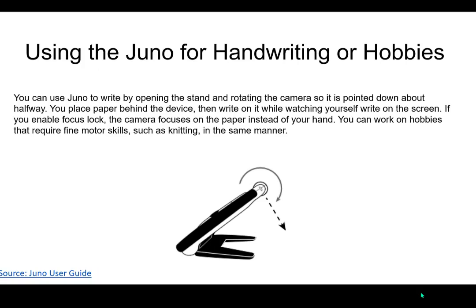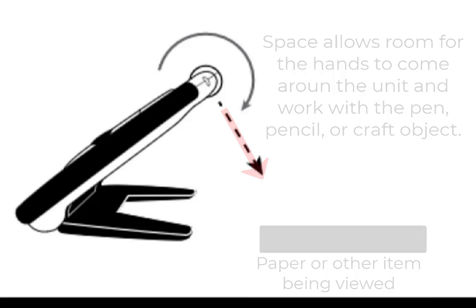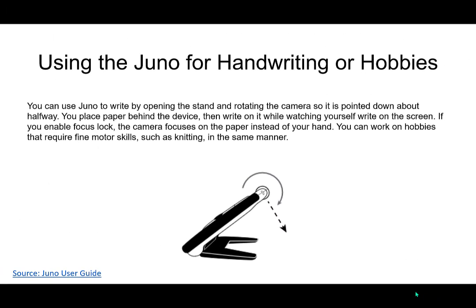You're going to place your paper behind the device. So the legs are going to be out. The device is going to have a camera pointing down, and you're going to direct that camera onto where you want that writing. You're going to be able to work on things like hobbies. You can do spot checking on things, stuff like that.